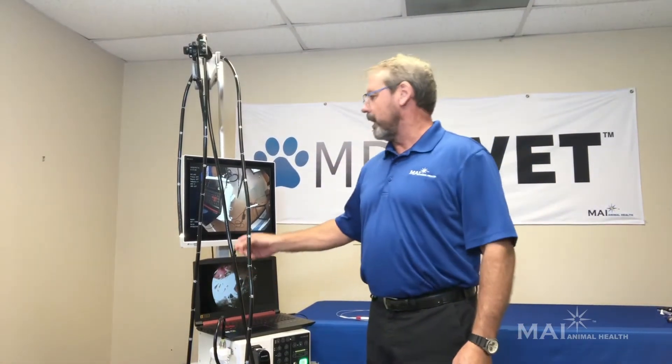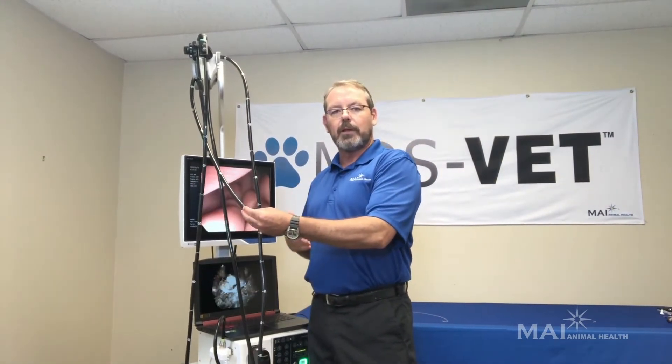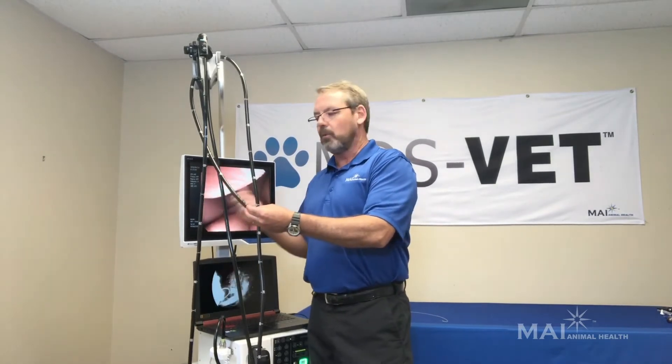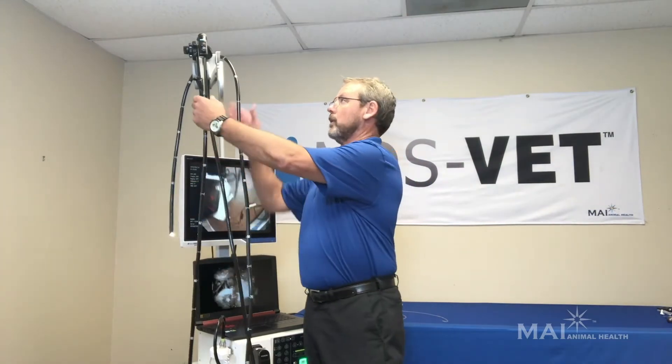This particular model I have here is our equine gastroscope. We also have small animal scopes ranging anywhere from 6 millimeter diameter up to 9.2 millimeter diameter, with biopsy port sizes going from 2 millimeter up to 3.7 millimeter on this particular scope.